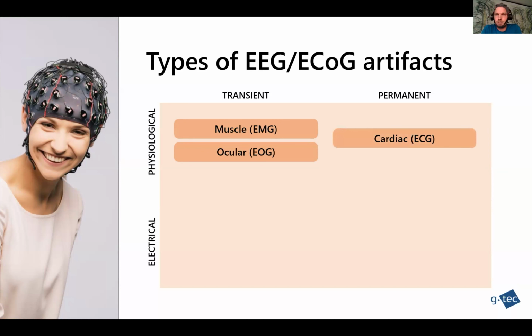A typical permanent artifact stems from the heart. So cardiac artifacts or ECG artifacts are captured when you are recording EEG close to a blood vessel. Usually when you are placing the electrodes correctly and they have good recording impedance, then you're not capturing that. But unless your heart stops beating, this is also a permanent artifact, which occurs roughly once a second.